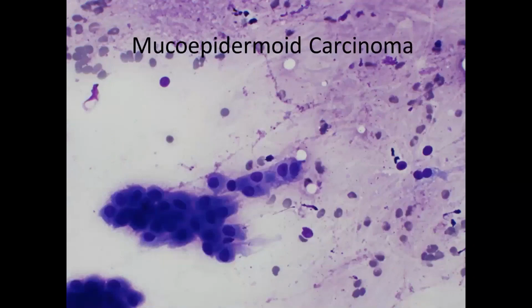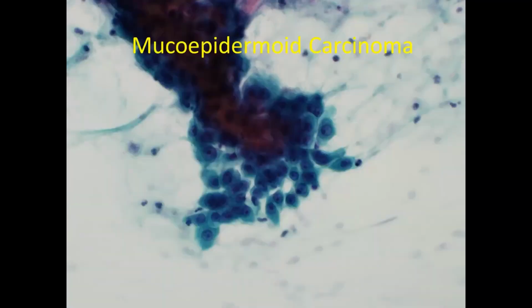So again, in mucoepidermoid carcinoma, the epithelial component, the cells will actually be very nondescript. A lot of times they can look a bit oncocytic as well, but usually what you get is this more abundant, angulated cytoplasm, very vaguely squamoid, like what you see in metaplastic cells in the pap. And there can be a bit of granularity. These do overlap a bit with the granular pattern. So vaguely granular, vaguely squamoid, mucinous background, relatively bland cells, those will be your clues for a low-grade mucoepidermoid carcinoma. Once you see the mucin and these nondescript squamoid cells, obviously you want to start looking for goblet cells as well.